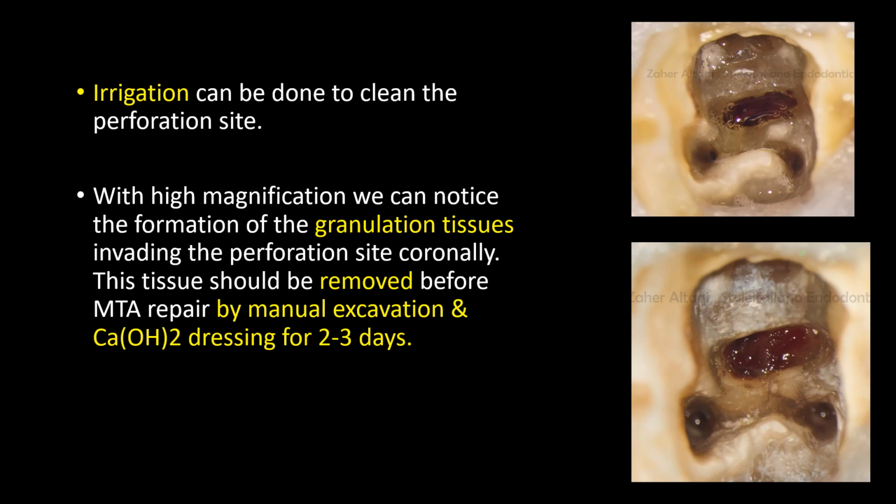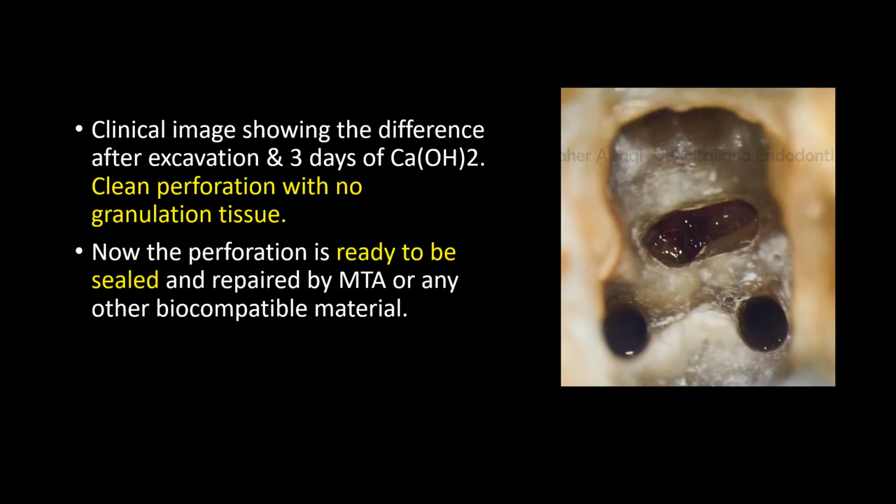This tissue should be removed before MTA repair by manual excavation, and calcium hydroxide dressing for 2 to 3 days. Clinical image showing the difference after excavation and 3 days of calcium hydroxide dressing. Clean perforation with no granulation tissue. Now the perforation is ready to be sealed and repaired by MTA or any other biocompatible material.